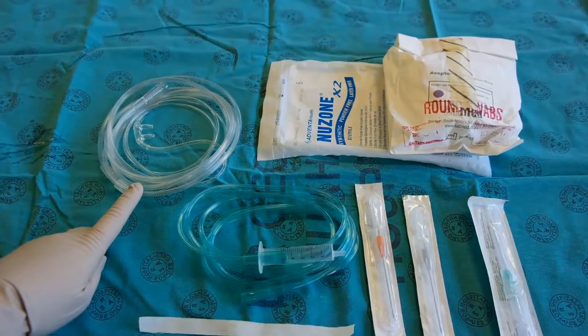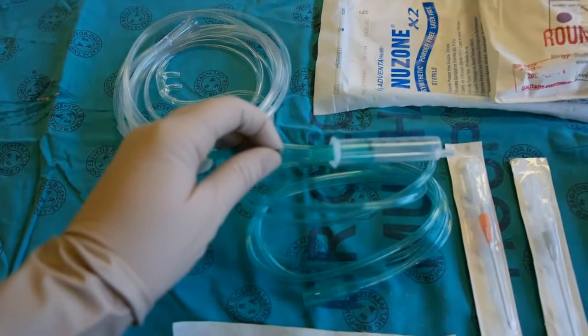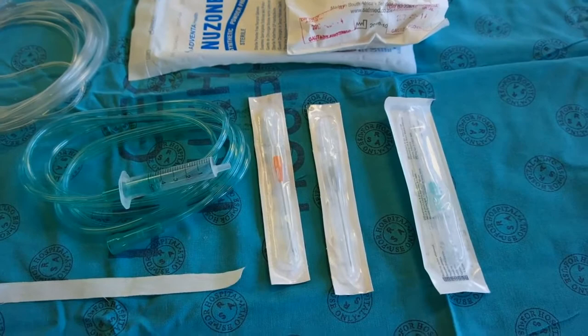Equipment you will require for the needle cricothyroidotomy: nasal prongs for passive oxygen delivery during the procedure, cleaning materials and sterile gloves, an oxygen source, oxygen tubing with a small hole cut into the side of the tubing, and a 5 ml syringe attached to the oxygen tubing.